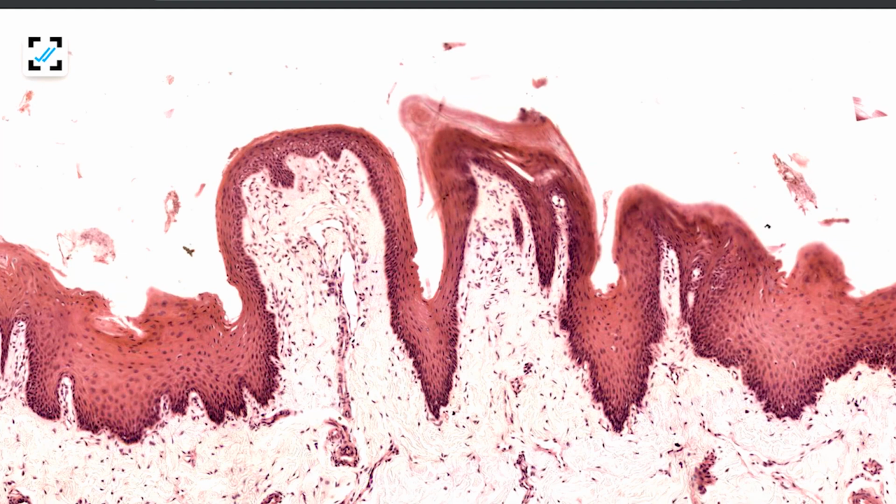All these features, absence of keratinization, plenty of blood vessels in the connective tissue, and a thinned out stratified squamous epithelium, all these give the fungiform papillae a characteristic bright red appearance. So, when we see these fungiform papillae in the living, they appear as red dots on the dorsal surface of the tongue in between the filiform papillae. This is regarding the structure of the dorsal surface of the tongue, which shows lingual papillae.